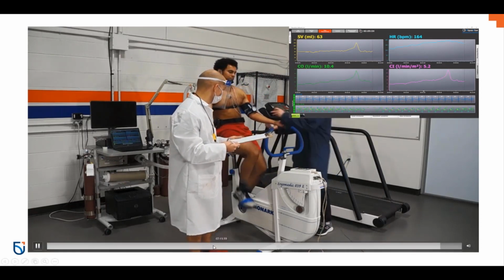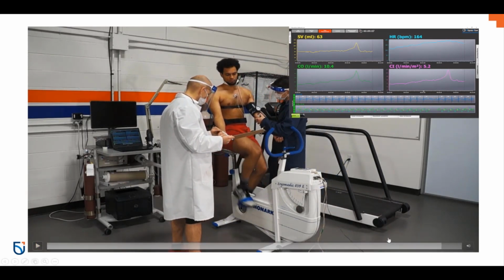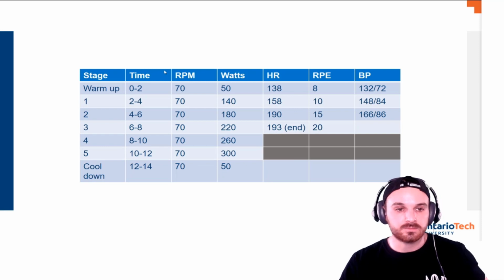So from that, I think we can stop. We're just running him through a cool down now and taking baseline measurements just to make sure that he's coming back down. So I'll come back here.